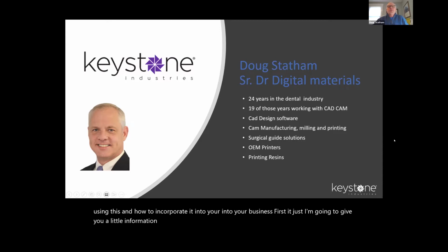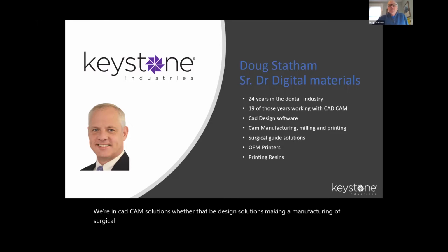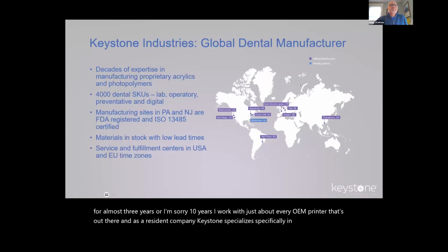If you're not familiar with us and myself, I've been in this space now for 24 years. Most of those years were in CAD/CAM solutions, whether that be design solutions, making and manufacturing of surgical guides, and a number of other things, including milling and now 3D printing, which I've been involved in for almost 10 years. I work with just about every OEM printer that's out there, and as a resin company, Keystone specializes in the dental resin market. Keystone has over 4,000 SKUs throughout the dental industry.